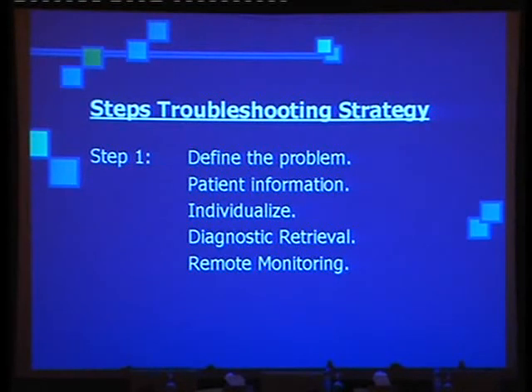Remote monitoring. Nowadays, some companies have these facilities. Usually it gives the physician a hint about the problems because it is connected to the network. So it can give an early indication of what the problem is: is it a lead problem, or a device problem, or instability in the patient hemodynamically.